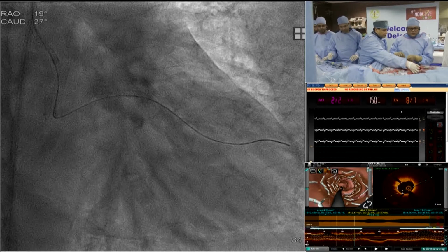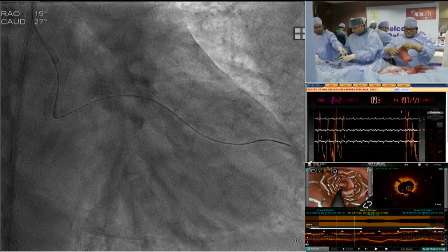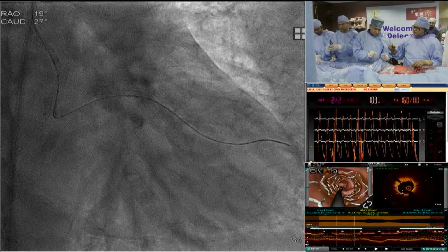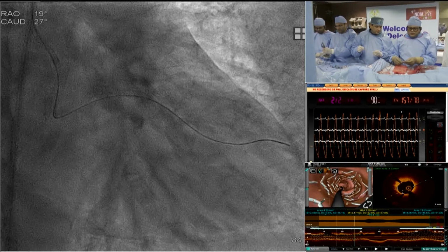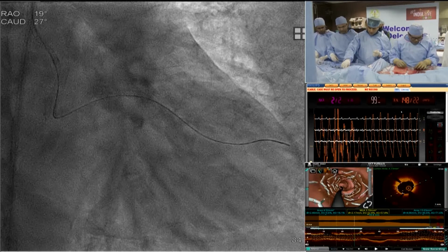Yeah, in our case, we would treat the acute lesion right away. And with all the remaining lesions, if they are critically tight, we'll probably do it in the same hospitalization, which might even be the next day. But otherwise, like Dr. Sharma said, we will bring them back after a few weeks and then treat those. Dr. Subhash? I quite agree with it. In this particular case, this is the perfect approach because those lesions were not critical. Praveer? Sandeep? Everybody agrees, huh?